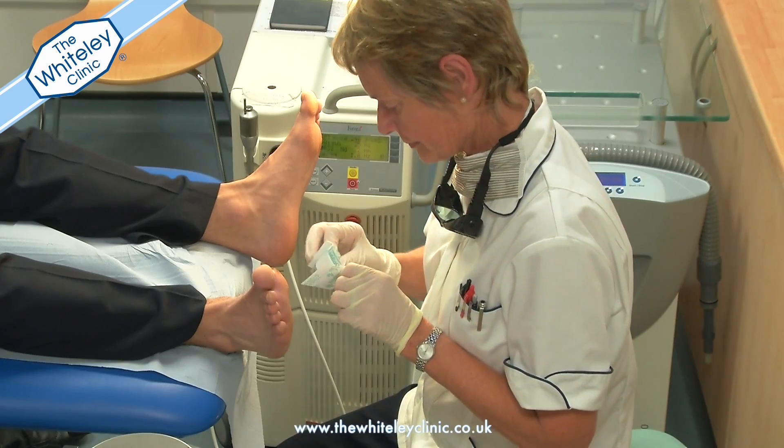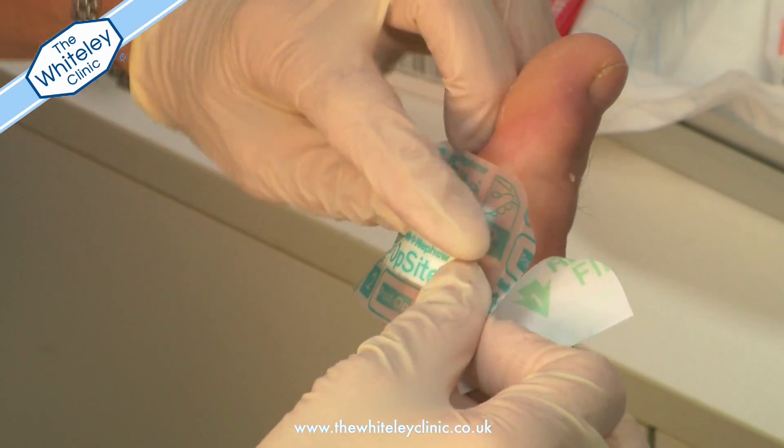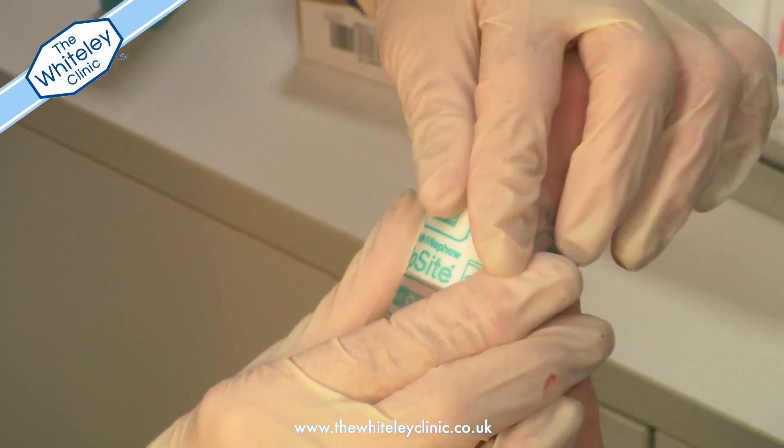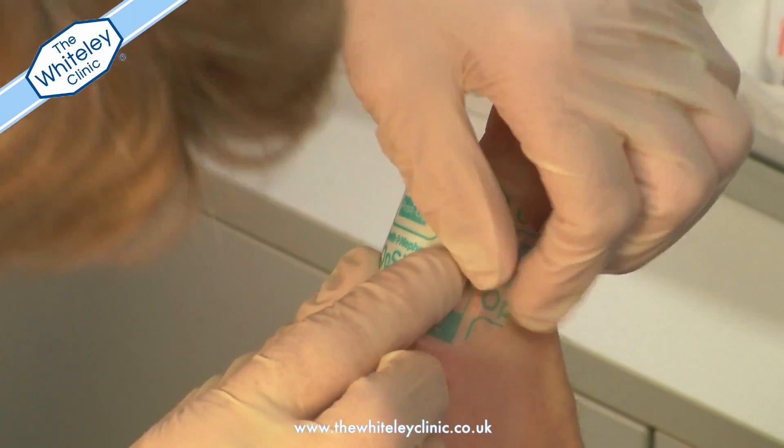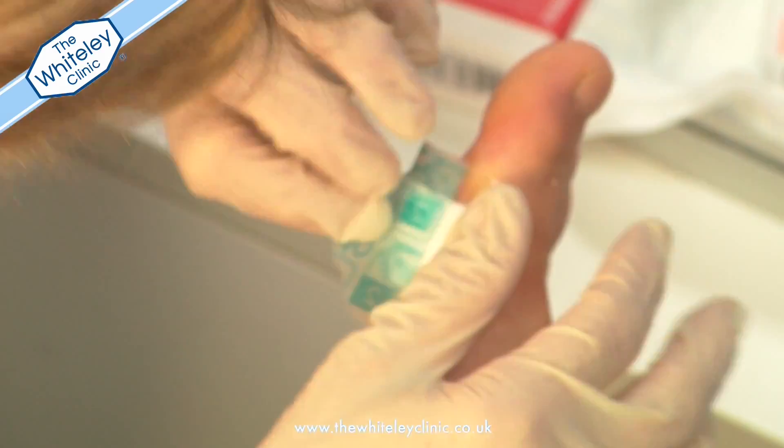Very little care is needed after the treatment of verruca with laser. Just simply keep it covered but not necessarily dry and continue with your life as normal.